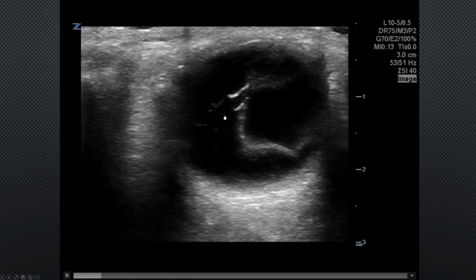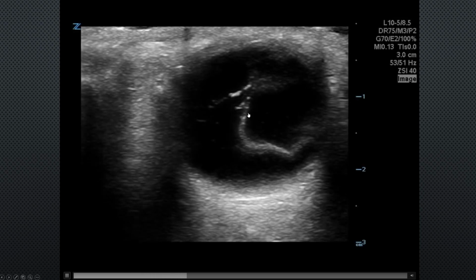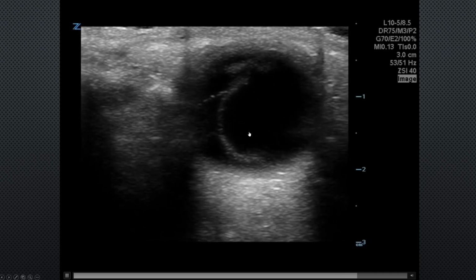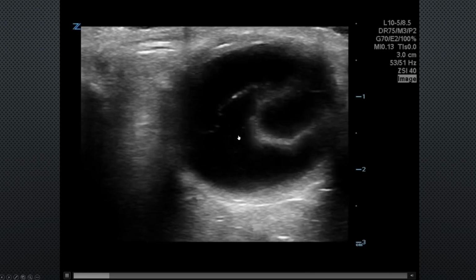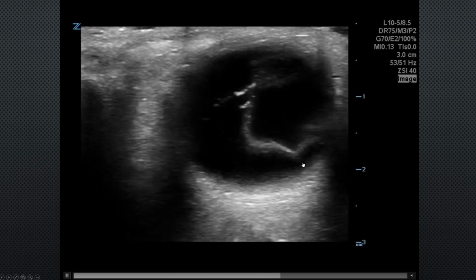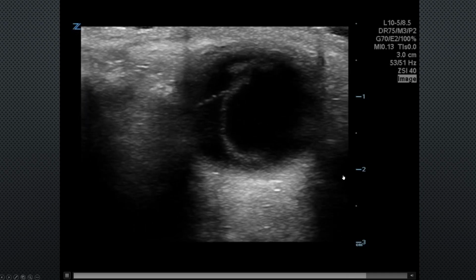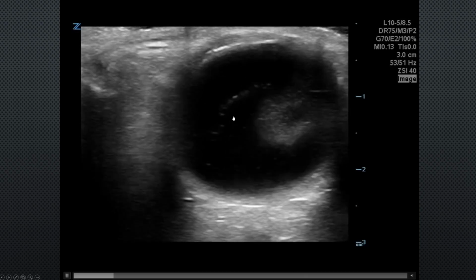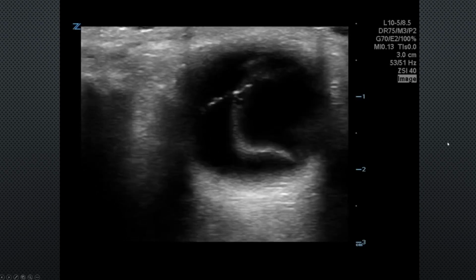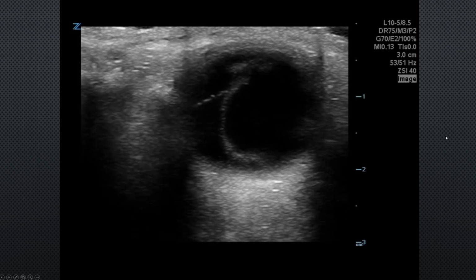Look at two ocular ultrasounds where, once again, we see this abnormal serpentine linear structure. We don't see it here attaching to the optic nerve, but in the next one we will. You can have some heterogeneous material, crystals and stuff like that. That can absolutely be associated with it.